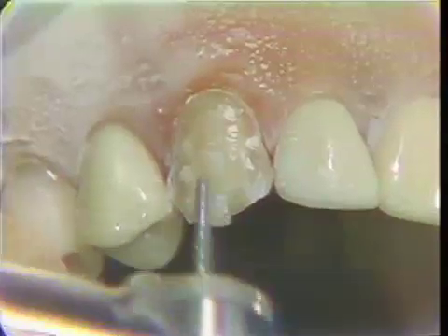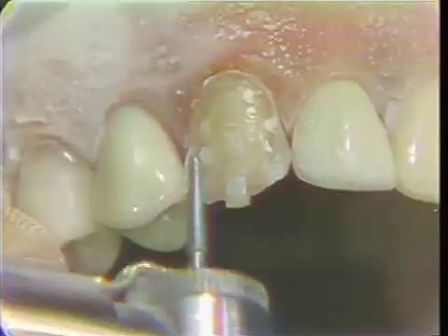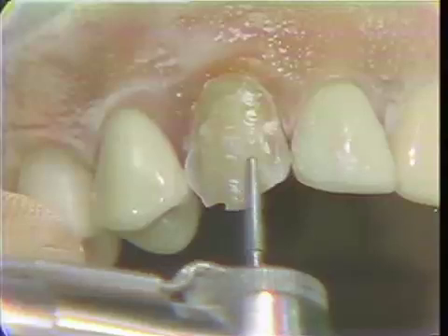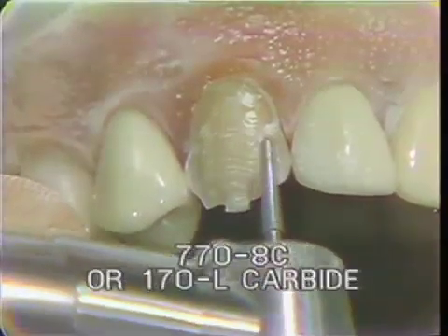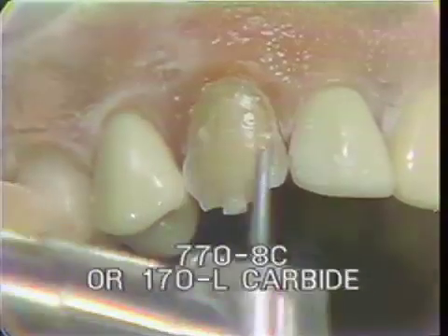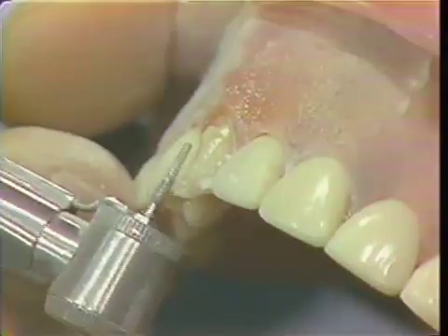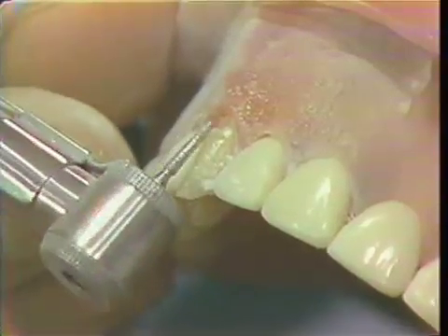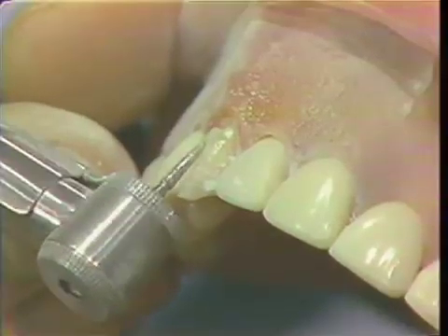Now we will start by reducing the incisal portion by cutting the little islands away, bringing this into the inner proximal. Now you will notice here, if we can get a profile shot of this, that this will be done in two planes. This is the incisal cut, and then the cervical cut will be in this plane, because that labial surface of the tooth is curved.